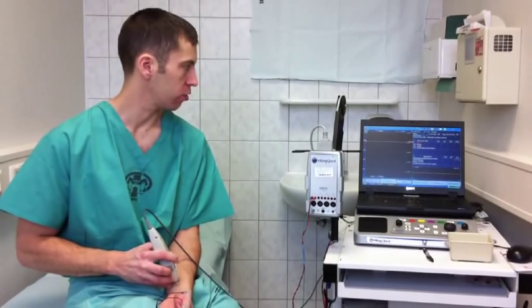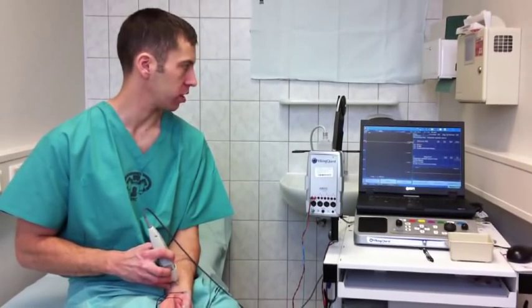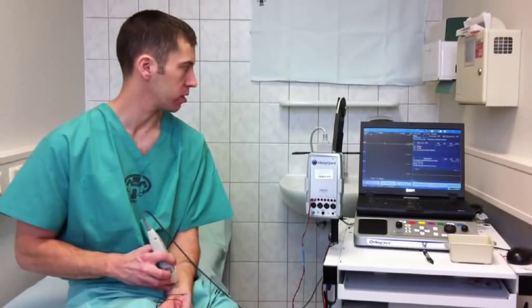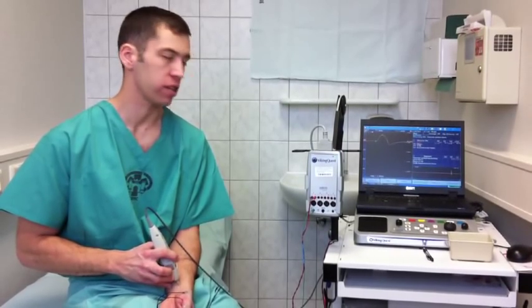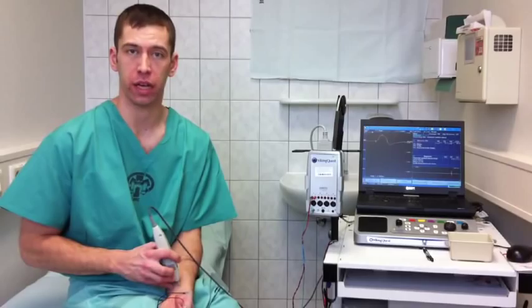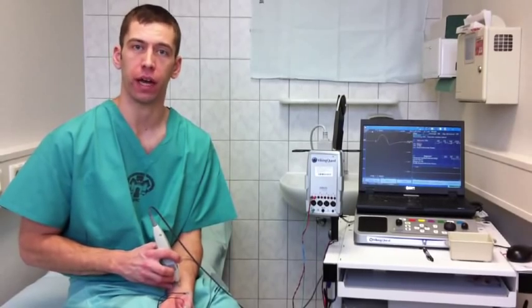Stimulation is applied, gradually increasing the amount of stimulus until we see a response. As you can see on the screen, a response was obtained and this information will then be analyzed.